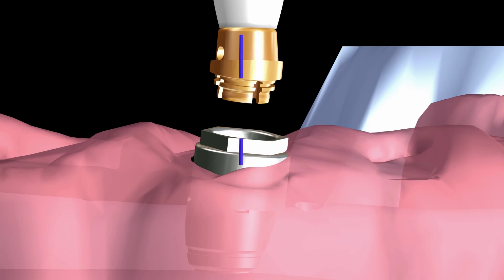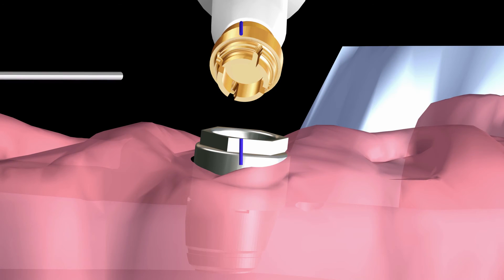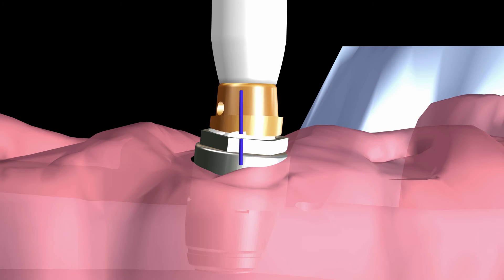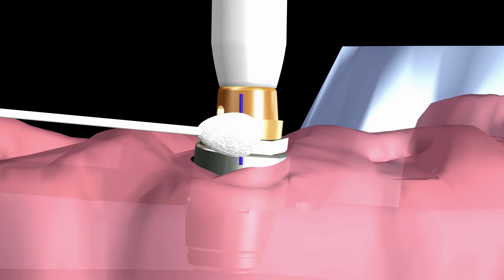The female is separated from the base. Resin cement is added to both parts, and the female is snapped firmly back into the base. Excess cement is removed.